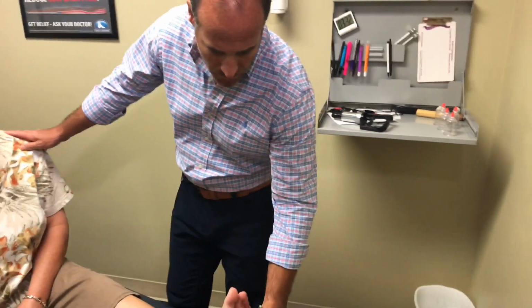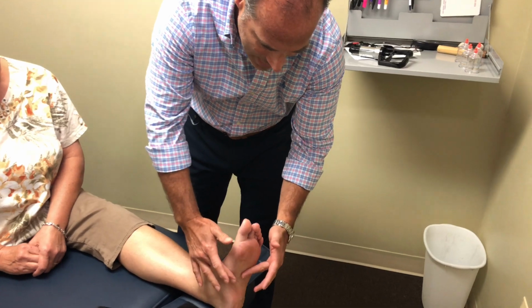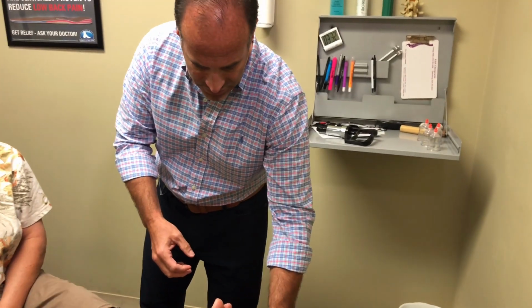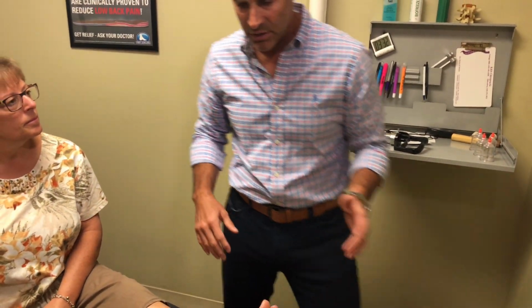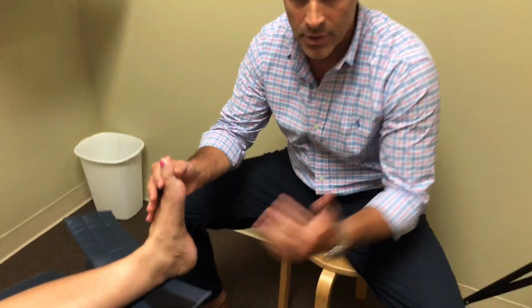The next thing we're going to do is some manual muscle work to strip these tissues down. Then we adjust her foot to get mobility, and we do what's called cupping. And cupping is used to help lift these layers of the tissue away from one another to take the pressure off of there. So let me explain a little bit about this. Nat, come on over here. So I'll show you this as we work on her foot.